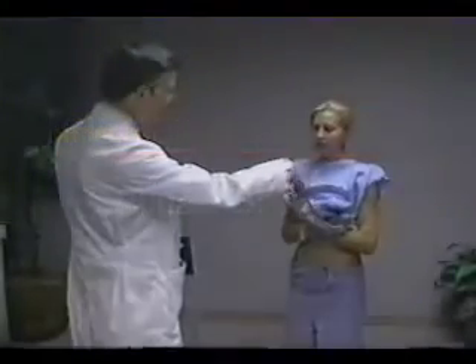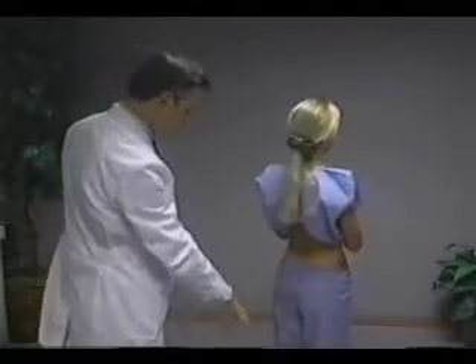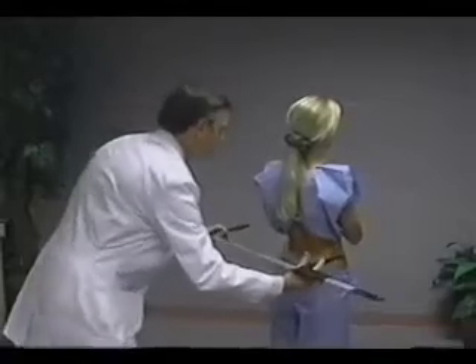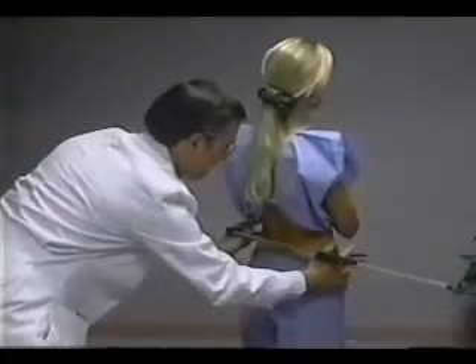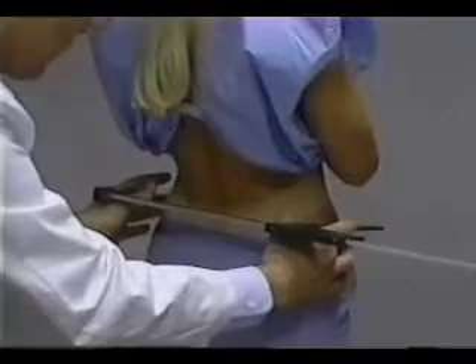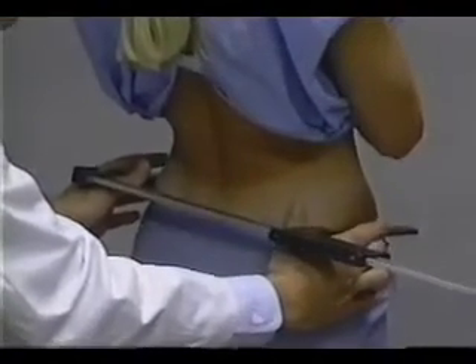Iliac breadth is taken while the subject is standing upright with the feet together and the waist area exposed. The technician stands behind the subject, resting the large sliding caliper between the thumb and index finger of each hand. Using the middle fingers, the uppermost lateral borders of each ilium on the mid-axillary line are located on both sides of the body.